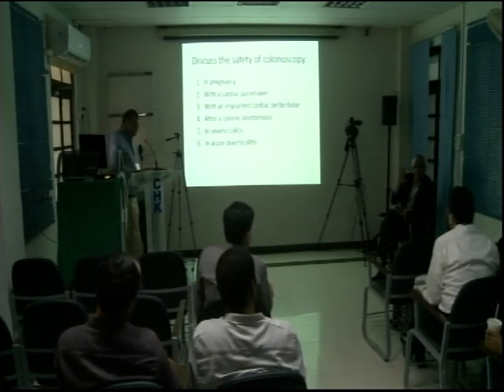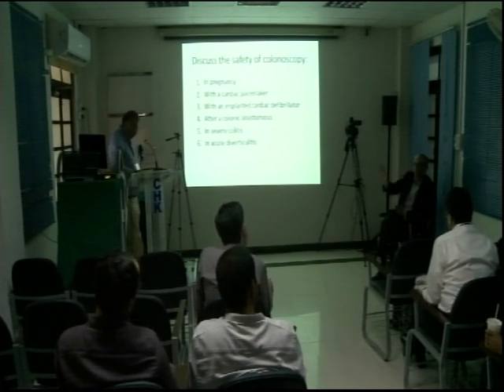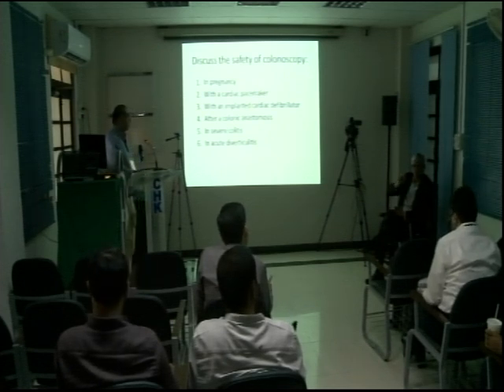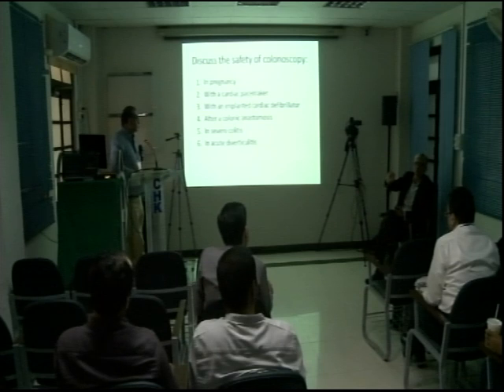You don't have to go in too much. Like he said, going into the rectum is enough. You'll see that it's bad. Take biopsies, come out. You don't need to know what the extent is now. And like he said, when the patient settles, make sure you write that this patient needs a colonoscopy to know the extent.